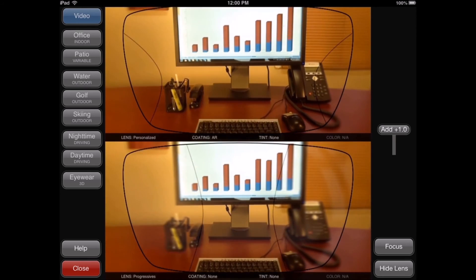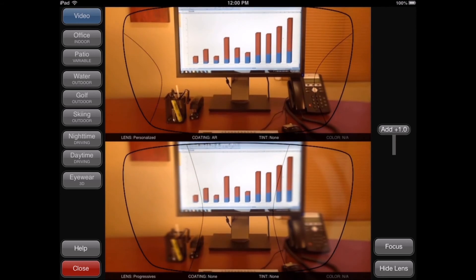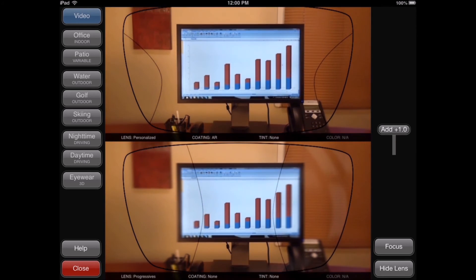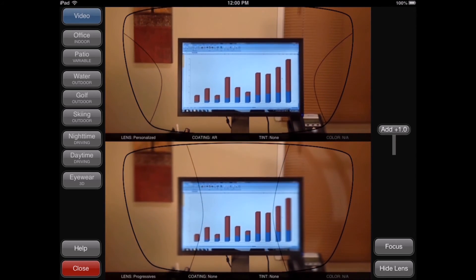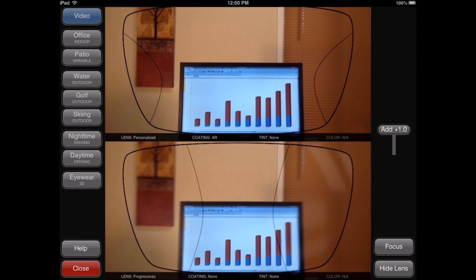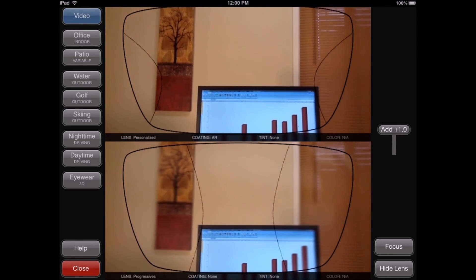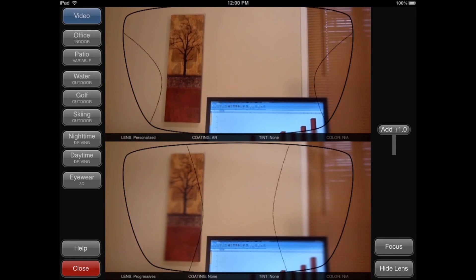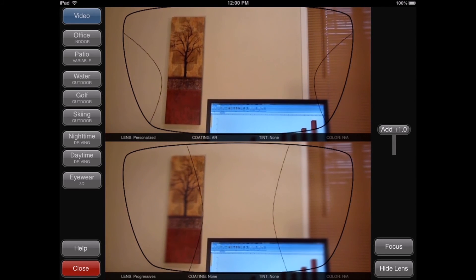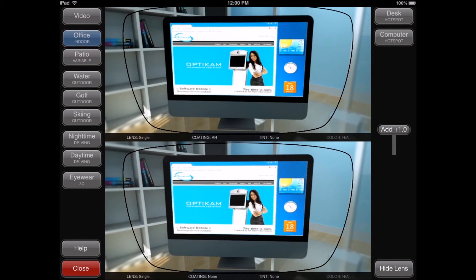This live simulation showcases the benefits of various lens options using your office setting. Point the iPad around different parts of your office to highlight various lens benefits. You can also select pre-loaded scenes which simulate lens options in a 3D environment using the buttons on the left side of the screen.